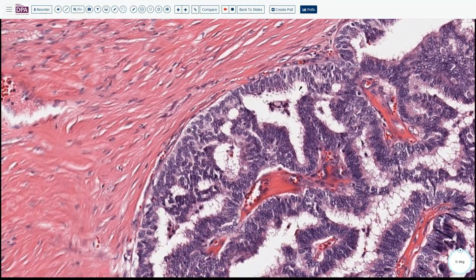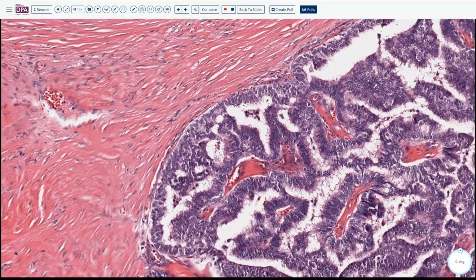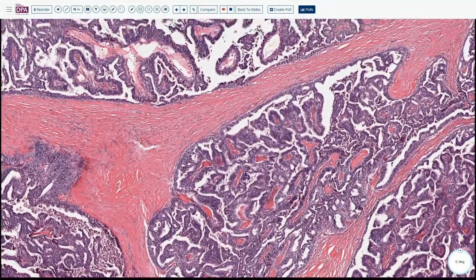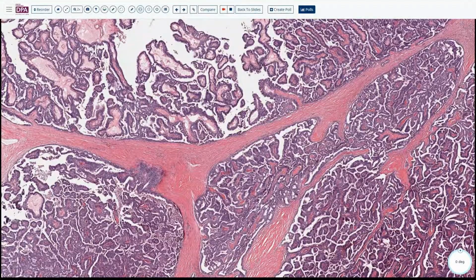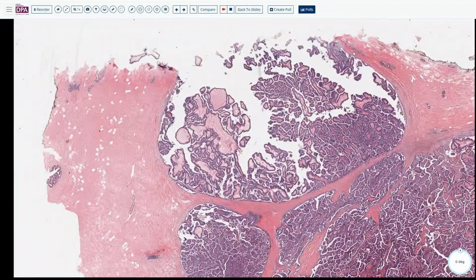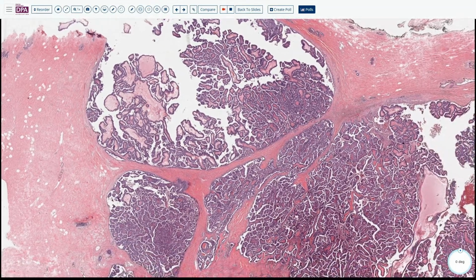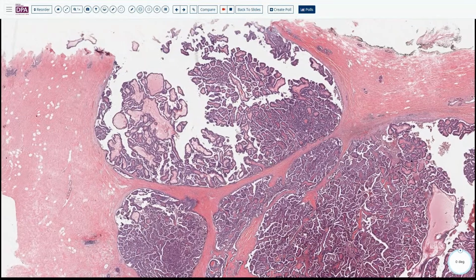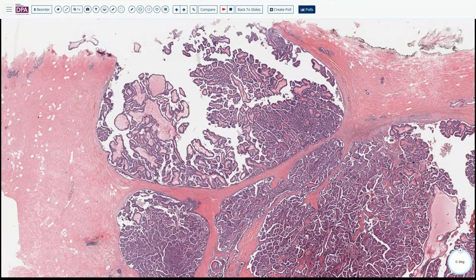Just for H&E, yes, you can put a differential like encapsulated papillary carcinoma and also maybe papillary DCIS if we have this myoepithelial cell layer. From the staining, we can use P63 and CK5/6 to highlight the periphery. We have a myoepithelial cell layer, so this is a papillary DCIS, not encapsulated papillary carcinoma. But does it matter? Usually it does not, because both of these are recognized as DCIS, and the treatment is the same.